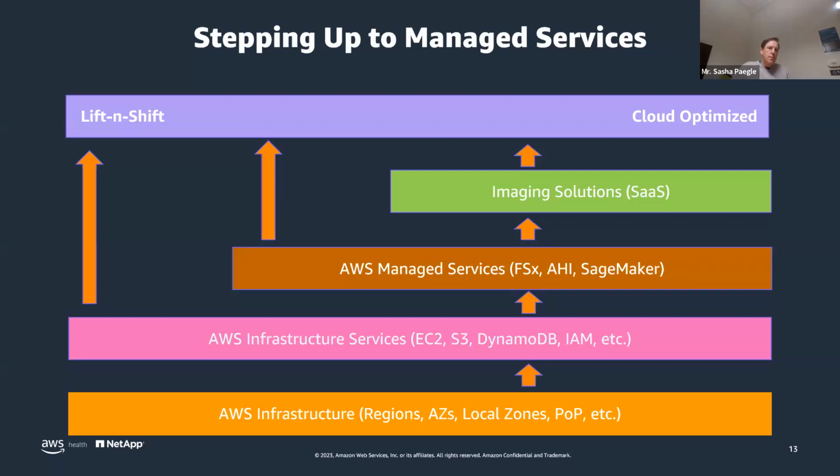When I say managed services throughout this conversation today, it often implies that a cloud provider, whether it's AWS or other options, has capabilities in play to take advantage of a file service, for example, like ONTAP, which has long been used on-prem to support imaging workflows, but delivered in such a way that you're able to use it for its management capabilities to manage images and deliver an imaging service or solution, without having to spend a lot of time thinking about the hardware infrastructure.